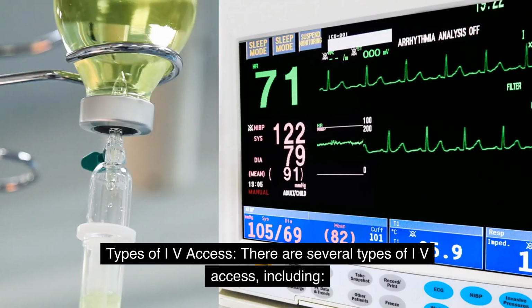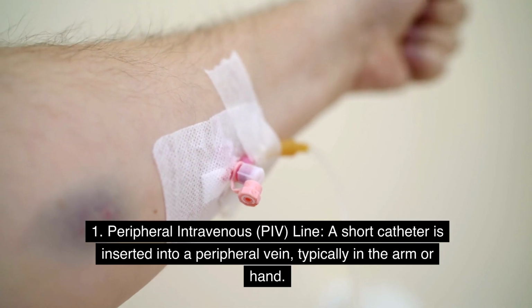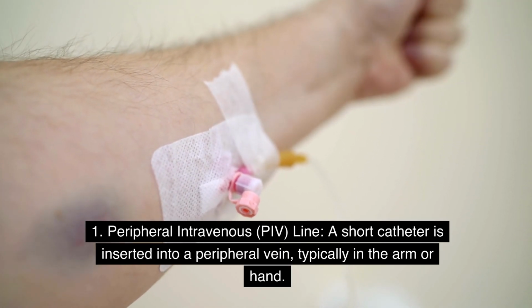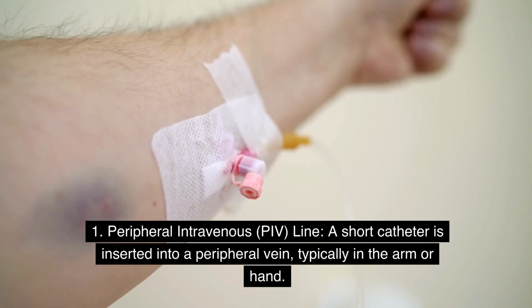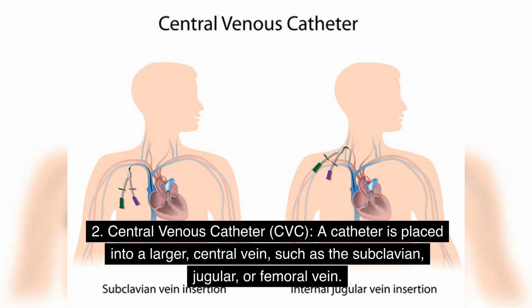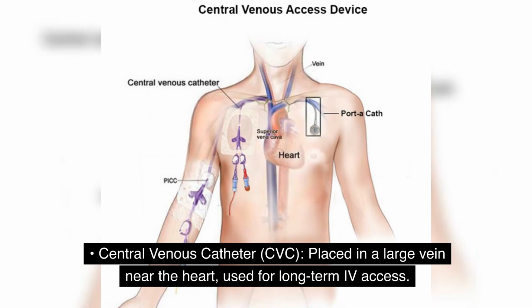Types of IV access. There are several types of IV access, including: 1. Peripheral intravenous (PIV) line. A short catheter is inserted into a peripheral vein, typically in the arm or hand. 2. Central venous catheter (CVC). A catheter is placed into a larger, central vein, such as the subclavian, jugular, or femoral vein. Types of CVCs include: central venous catheter (CVC), placed in a large vein near the heart, used for long-term access.